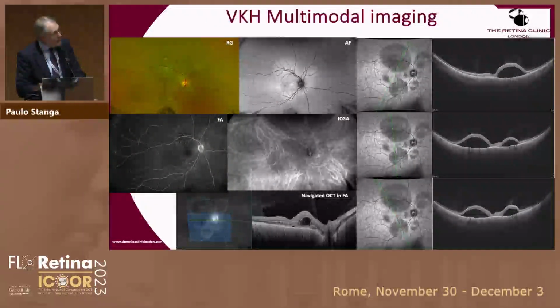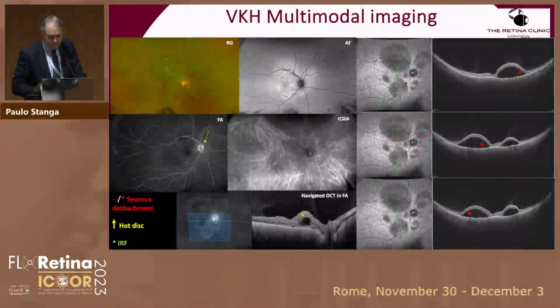This is a patient with multifocal Vogt-Koyanagi-Harada, and this is multimodal imaging. This is the way we assess these patients. And here you can see the multiple areas of serous detachment in this patient.